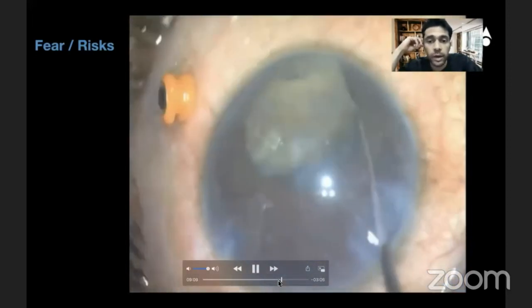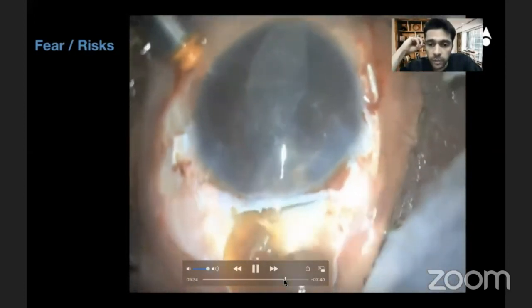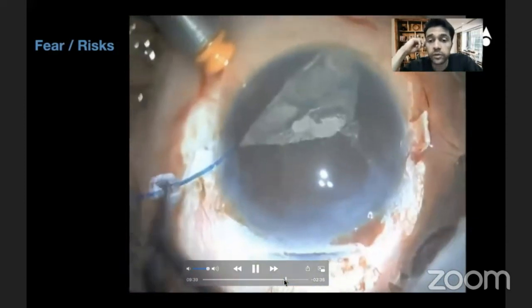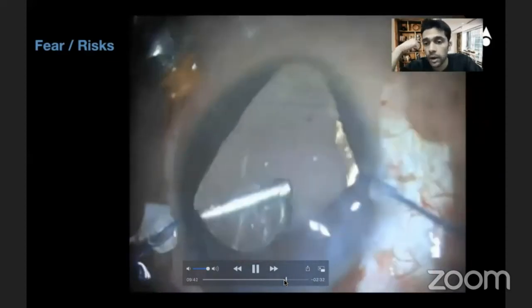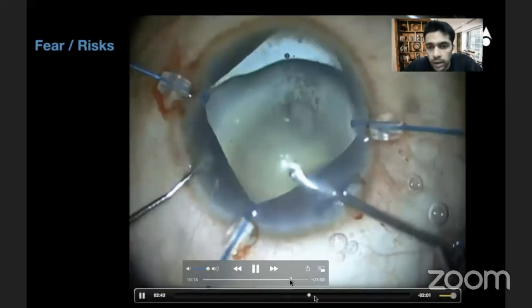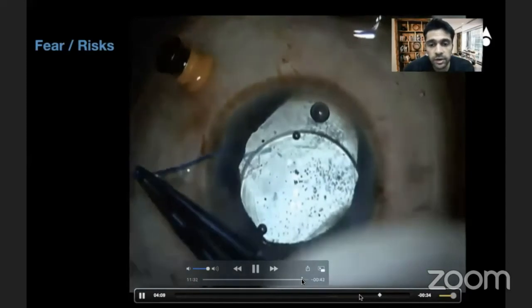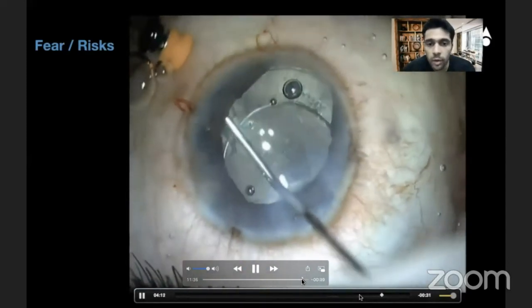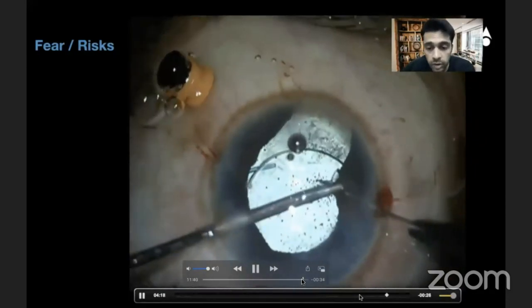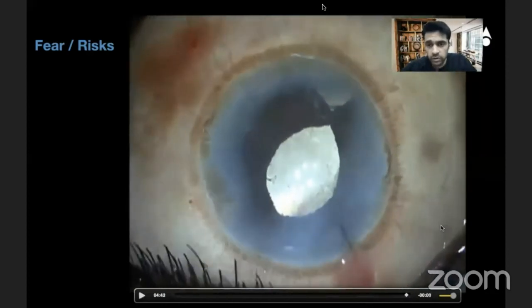In these scenarios, the nucleus comes out in one piece and once that is done I'm safe that it will not fall down. I put the iris hooks back in place, completely remove all the cortex, remove the iris hooks, and place a three-piece lens — because it can happen that one haptic slips with all the cortical matter removed. Make sure to do your single-pass four-throw pupilloplasty as well.